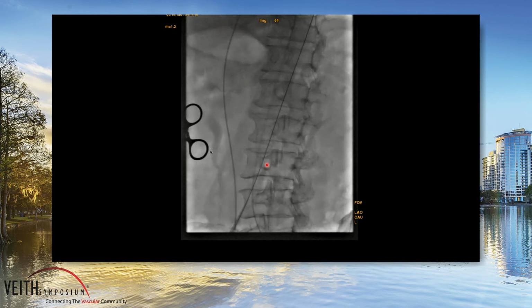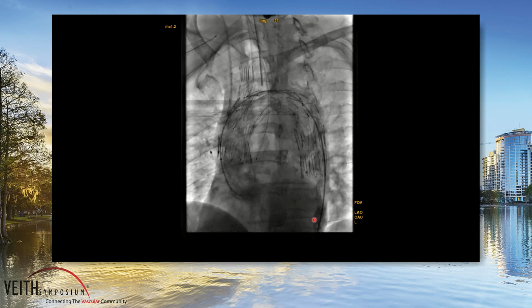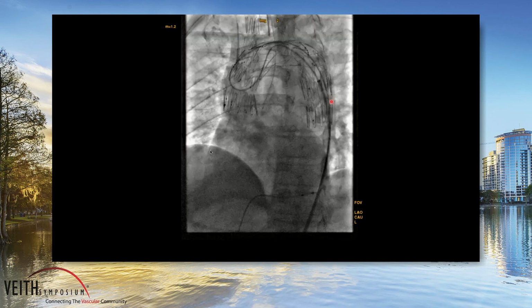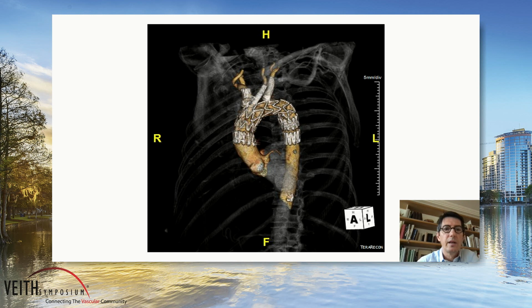And then the next step is to get access to the left common carotid. Once you have pushed this 5 French sheath through the two branches, the reverse catheter here pushes a wire that you snare from the groin. Here I'm snaring the wire. Now we're getting the large 10 French sheath all the way into the ascending aorta and pulling it back into the left common carotid. For the sake of time, next picture. I'm just going to show you the completion CT scan, and tell you that it's now our number one technique to perform those procedures in patients with chronic dissections.